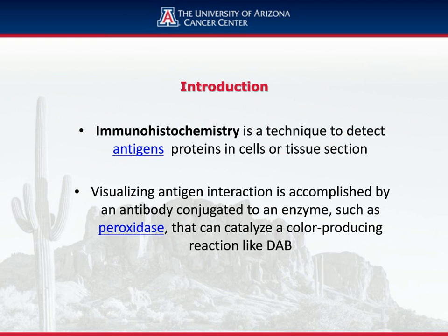I just want to give you a brief introduction into immunohistochemistry. We should all know what immunohistochemistry does. It basically detects a protein of interest using an antibody. And this is visualized using DABMap, which has been a standard for a long time.